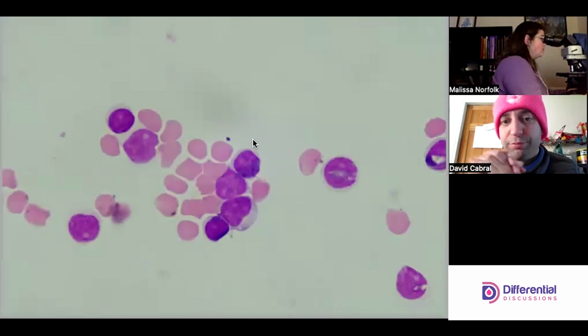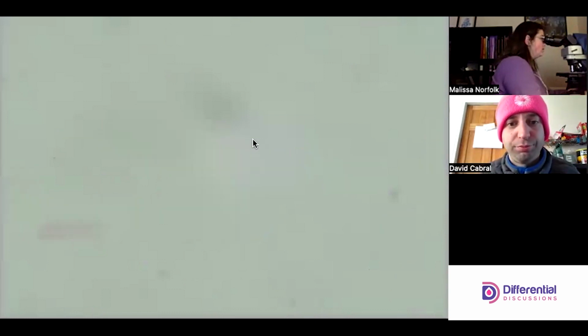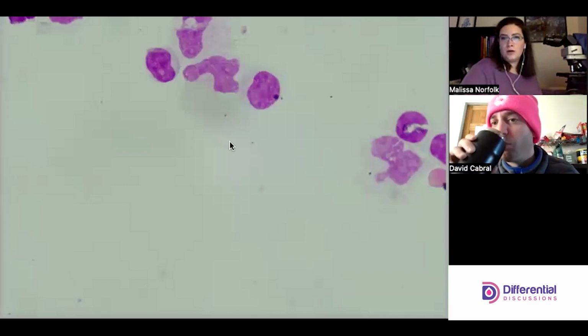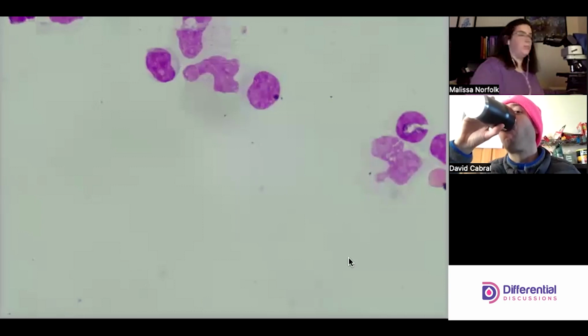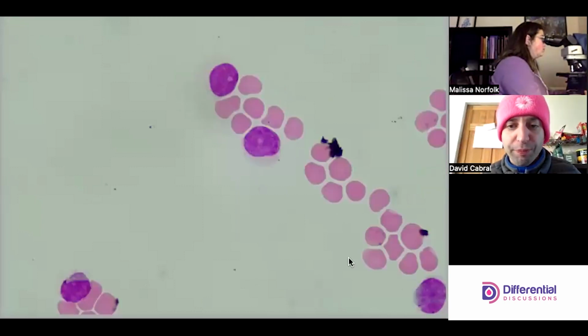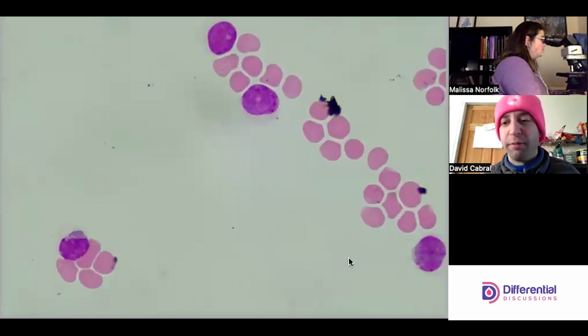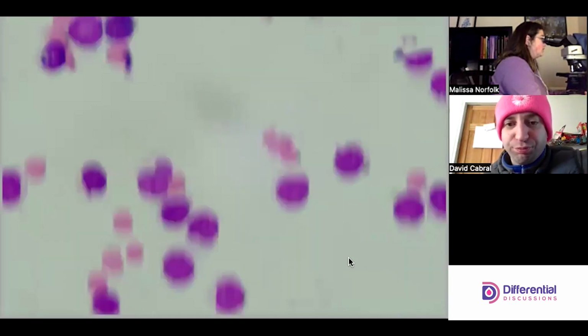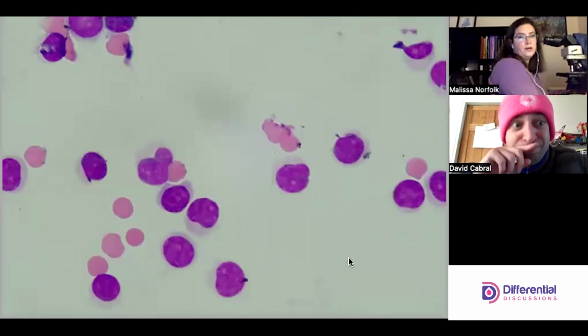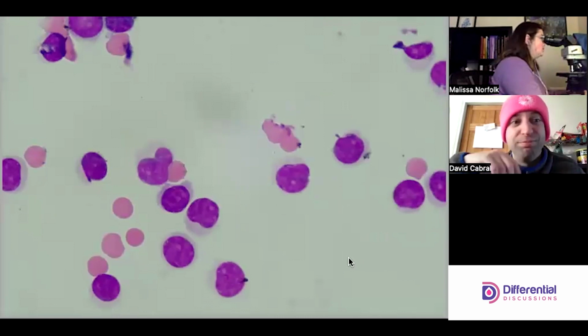All right, let's move over and go back. Mono or two. Yep. So we got a mono, a mono, a mono, a couple lymphs. Lymphs. Yeah, ton of lymphs. But yeah, I'm not seeing any of those big ugly cells that we saw in the balls of whatever clump of cells.